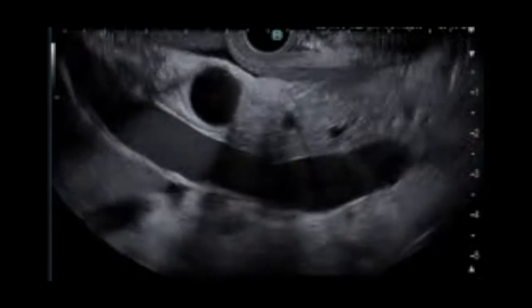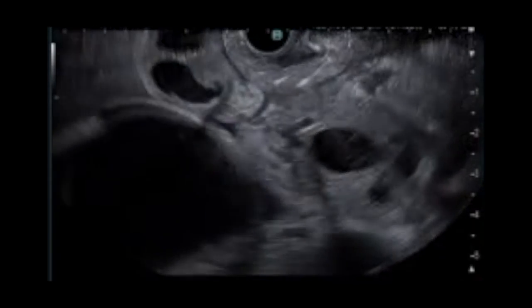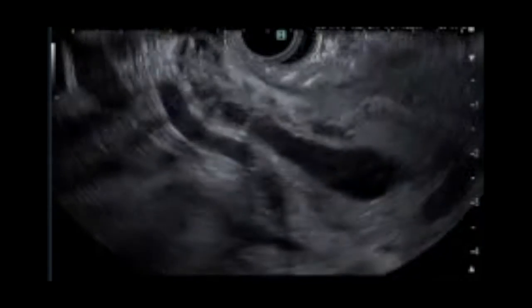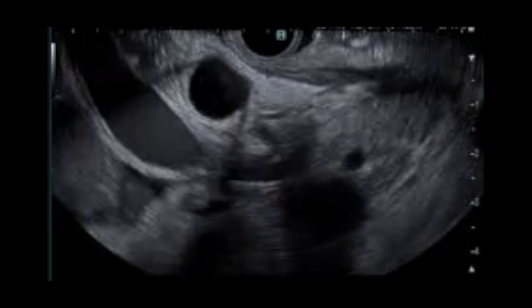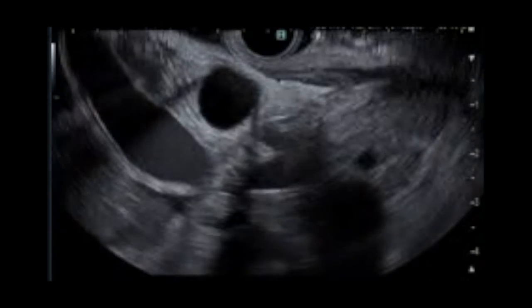Because of the acute angulation and interference of the proximal end of the duodenal stent in the duodenal bulb, avoidance of ascites with a transmural access to the intrapancreatic portion of the bile duct was not feasible. After prolonged examination from multiple locations, a clear window to the bile duct was seen just proximal to the stent within the duodenal bulb, although small amount of ascites was seen in this area.